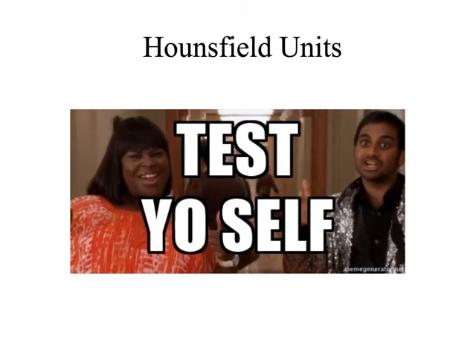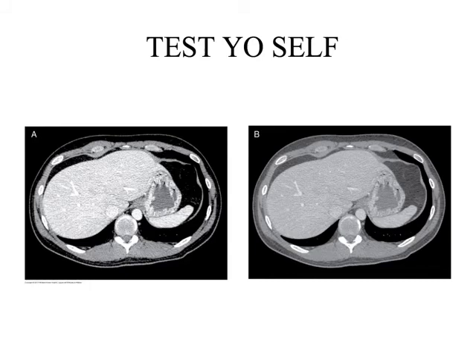Let's test ourselves a little bit about that. We've just spent a lot of time looking at these window width and window level changes, and this is the way it applies in the real world. Between these two images, which do you think the tech has changed, the window width or the window level? The width. Good. This is a window width change.